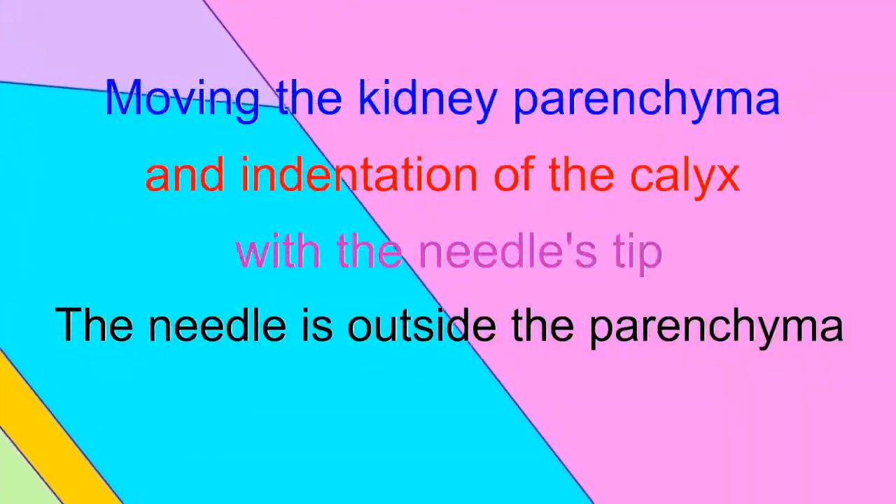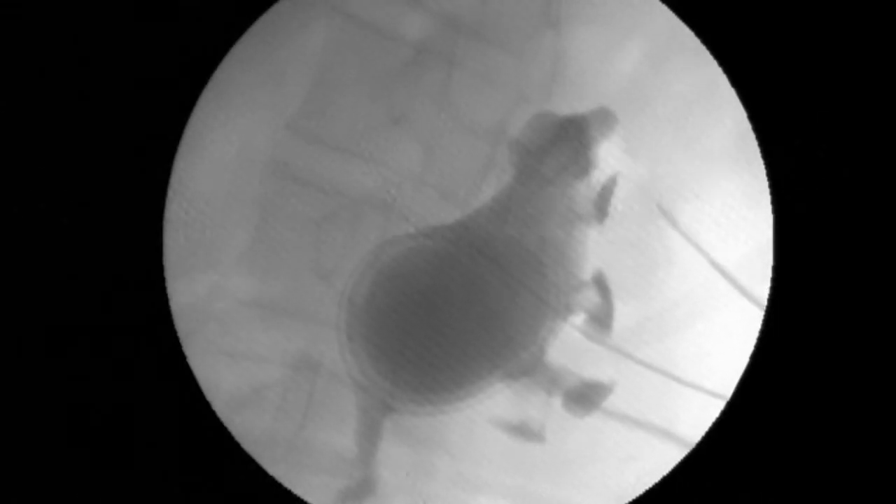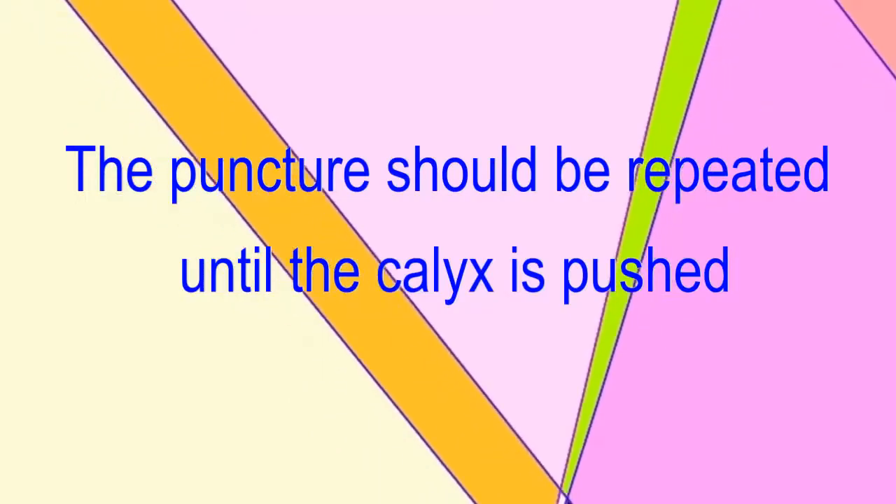To ensure that the needle is in the correct position, the calyx has to move with the parenchyma — the calyx will be pushed by the needle. The needle is still outside the parenchyma in this step. In one case, the kidney is moving but the calyx is not moving, meaning the needle is not in front of the calyx and should not be advanced. When the calyx also moves and is pushed by the needle, the needle is in front of the calyx — it is a good puncture.